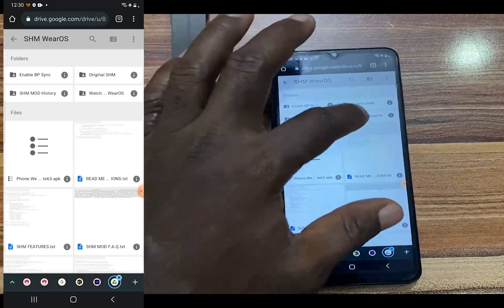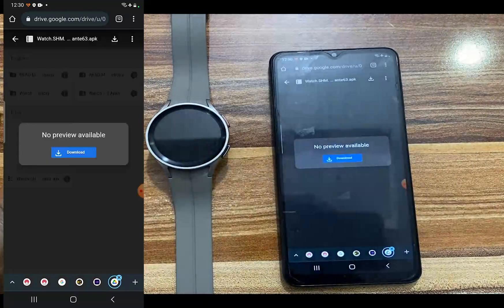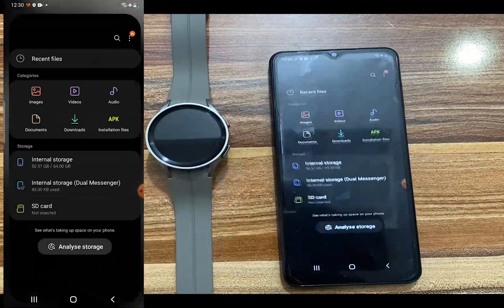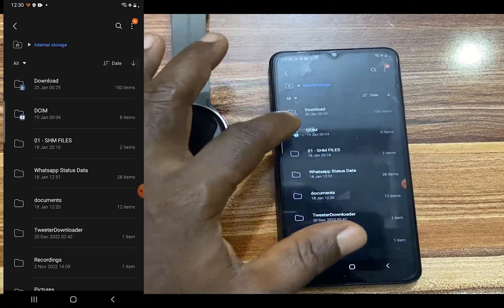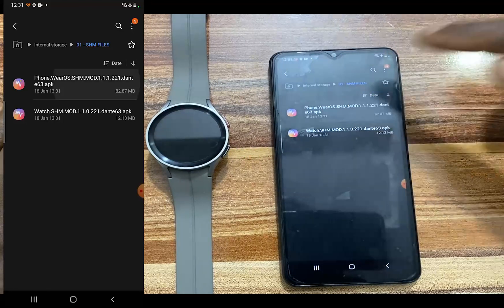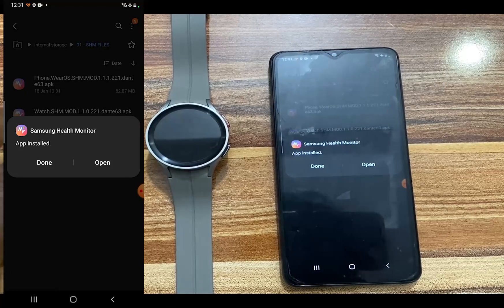Now, once you are done, download the second file. Open this folder that says watch. Now tap on watch.shm and tap on the download icon to download this file as well to your phone. Now once you have downloaded these two files — I have already downloaded and moved them to a folder for easy accessibility — what you need to do is to install the Phone.WearOS app on your phone. Tap on that particular app and tap on install. Once this file has been installed on your phone, just tap on done.